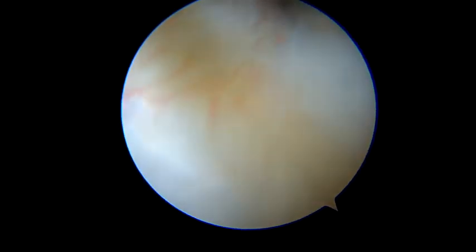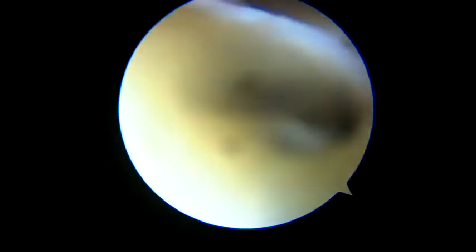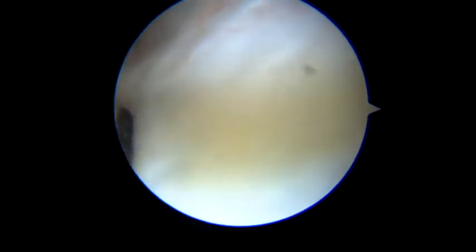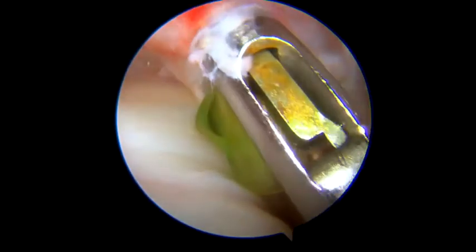Once a satisfactory amount of tissue has been gathered by the Clever Hook, it is possible to use a Shuttle Relay wire guide that has to be put inside the articular joint. Once positioned in the articular joint, the wire guide can be retrieved using an accessory portal.